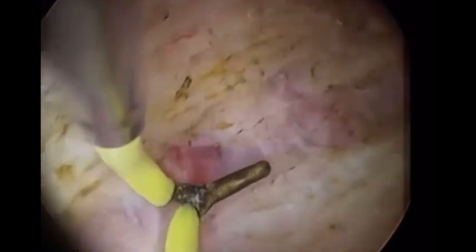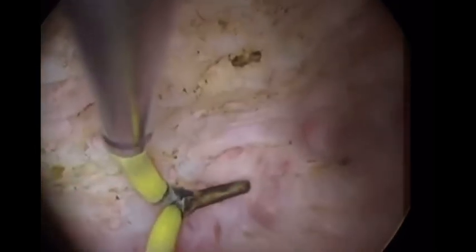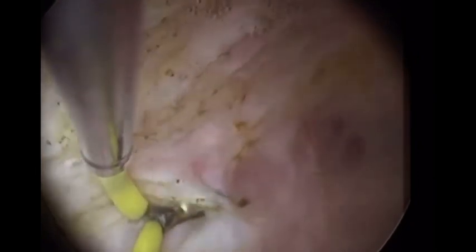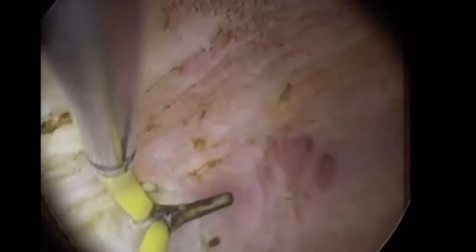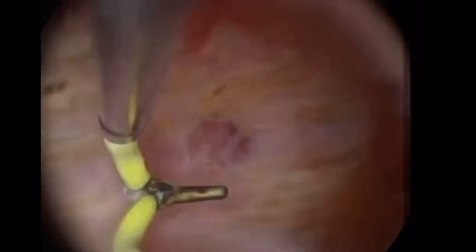Septum surgery is not just cut and forget. In many instances, the surgeon may cut the septum perfectly and achieve a beautiful postoperative cavity — but still there is no pregnancy. The key to success is achieving equal retraction of fibers, resulting in equal thickness of the anterior and posterior wall. Keep watching — more tips are coming.